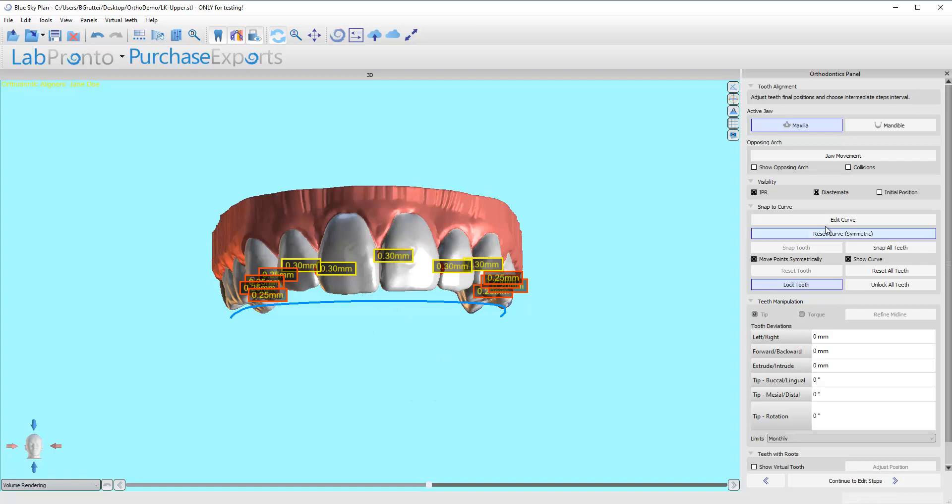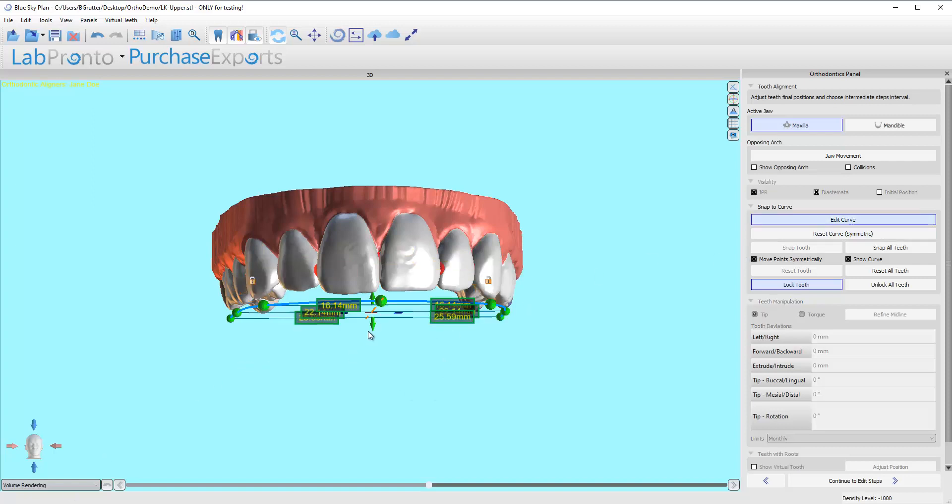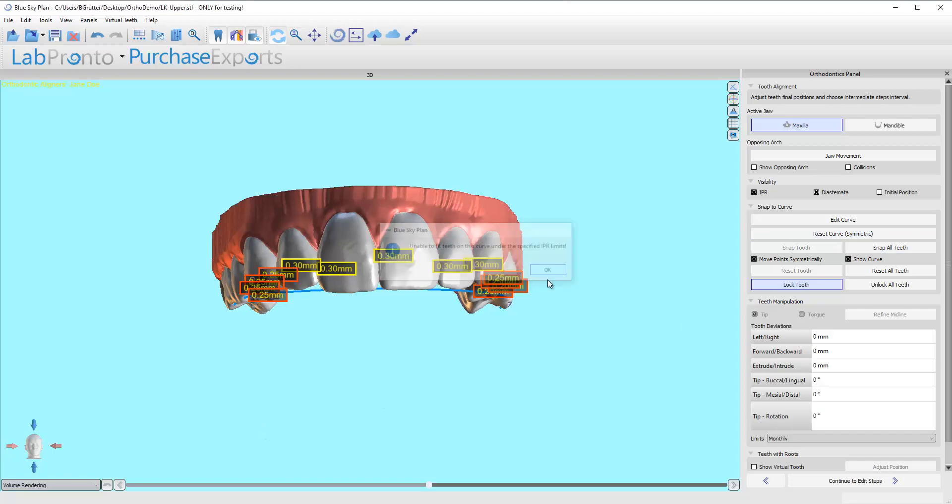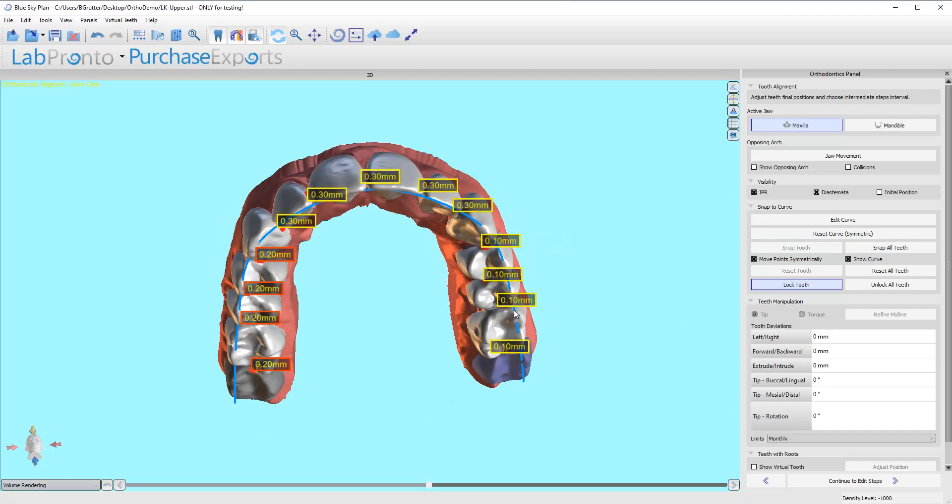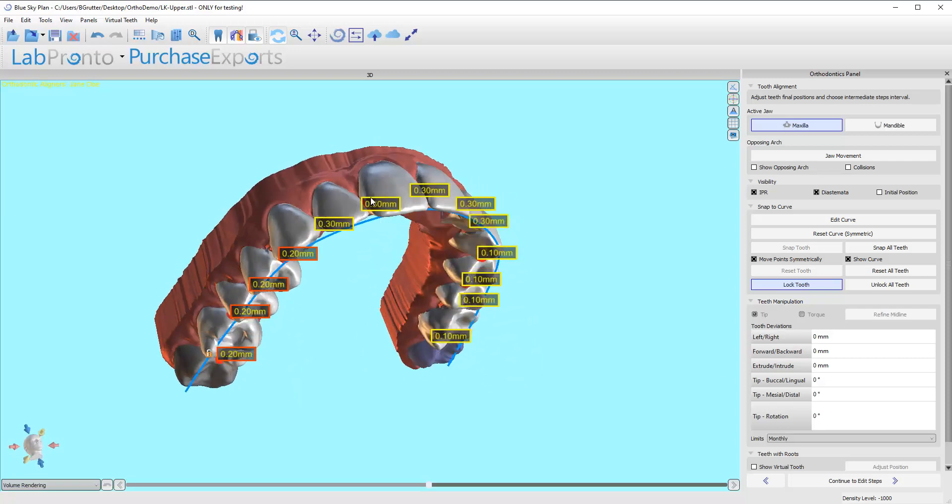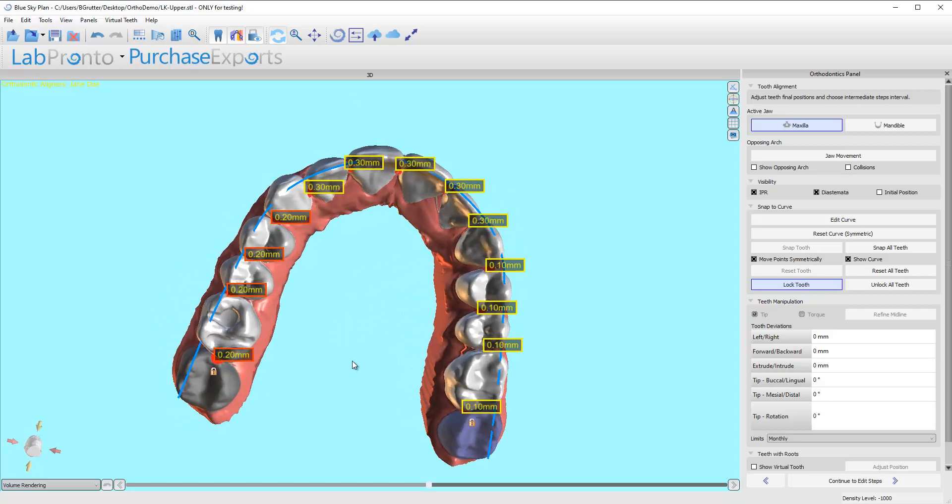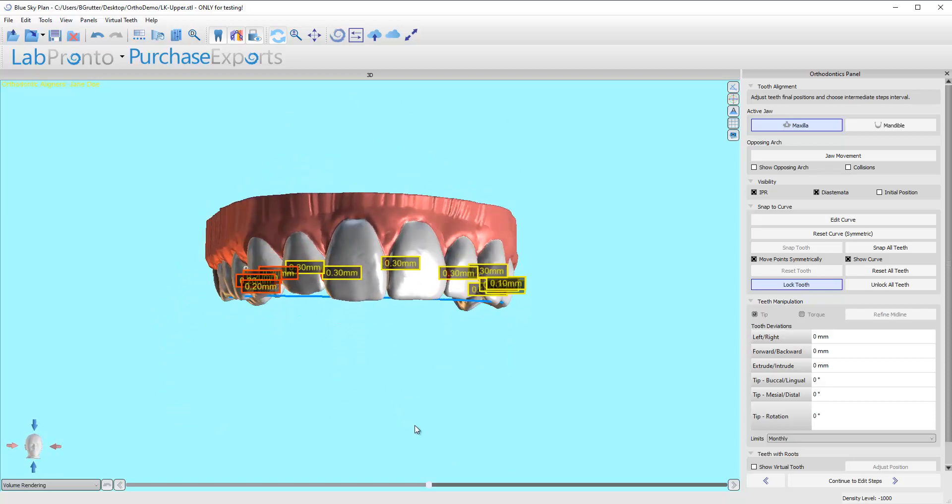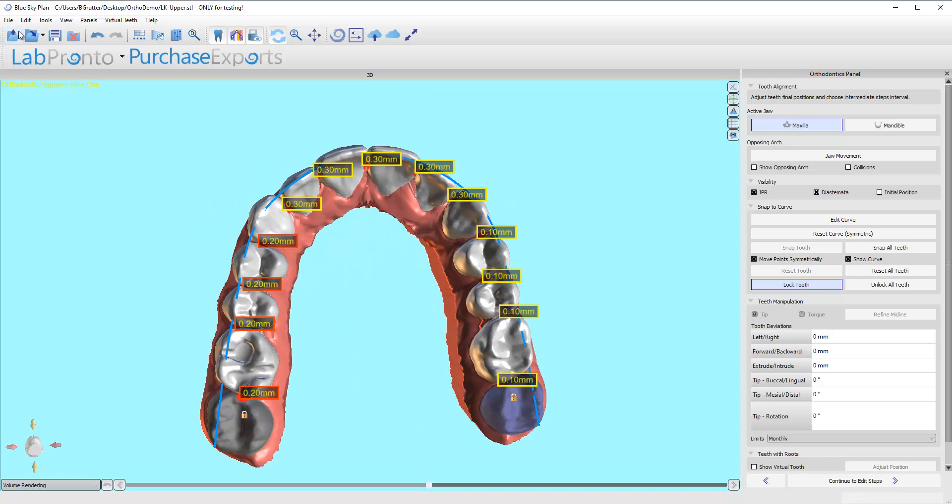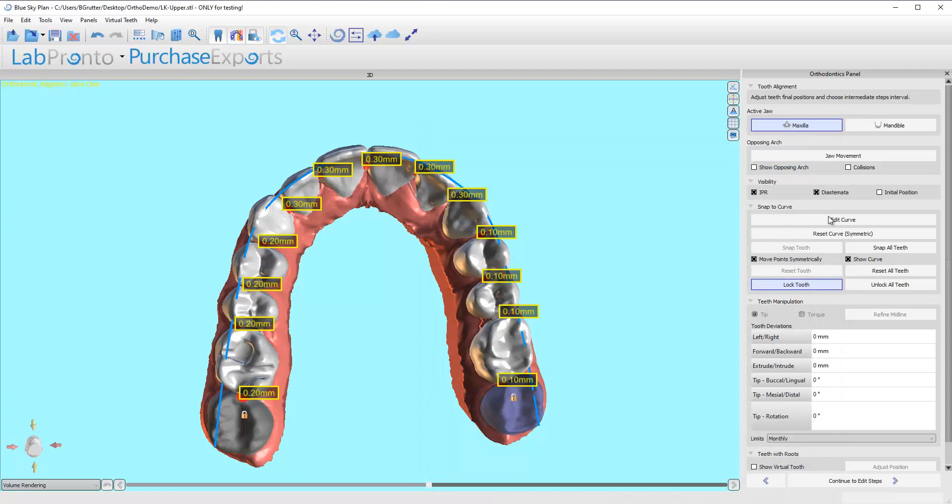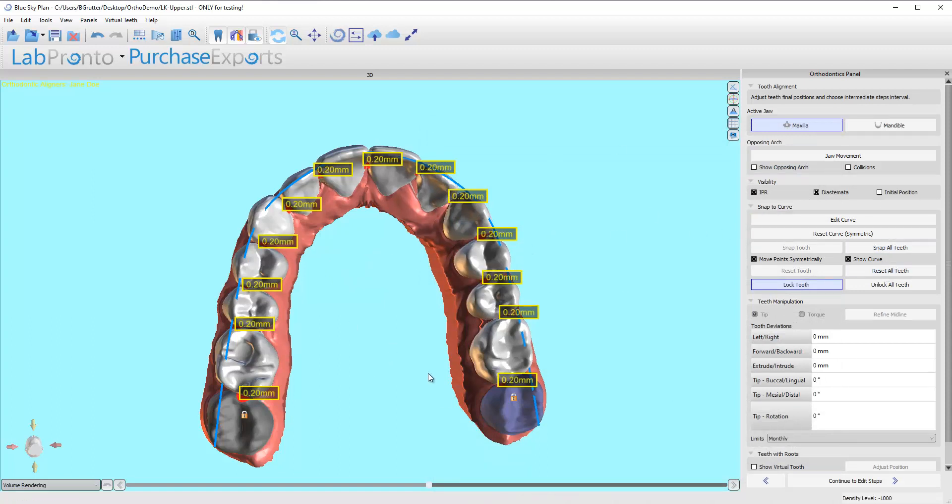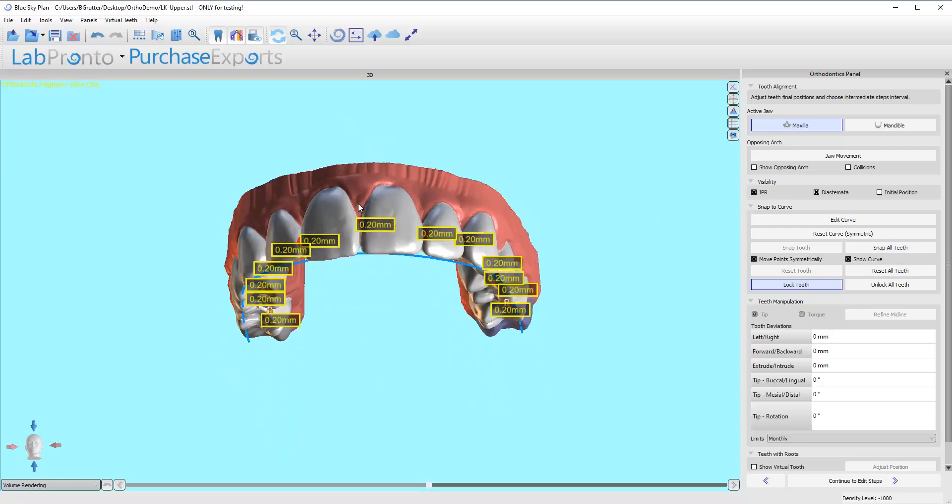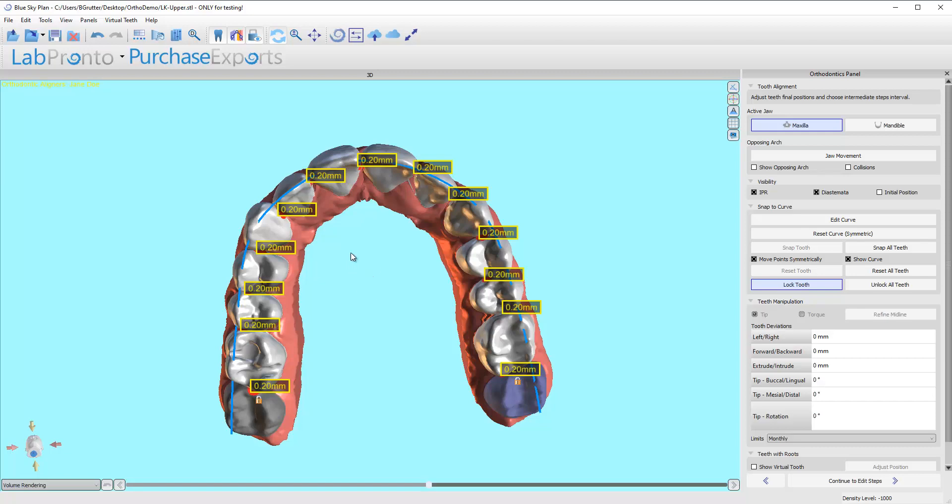If you really want to tweak this a different way, we can take the curve line and bring the curve closer to the teeth, turn that off, and say snap all teeth. The IPR values are reducing a bit—0.1 here now, 0.2—it was 0.25. So by bringing it lower, it actually causes all the teeth to flare out a little more. I don't do that a lot, but if I just need to fine-tune things just a little bit, that's what I'm going to do. Let's come back up to my preferences—I don't like having it quite like that—and let's say we'll limit each one to 0.3. Snap all teeth, let it rebalance everything out, and now we're at the 0.2 range everywhere. Personally, I'm probably okay with it in this arch.